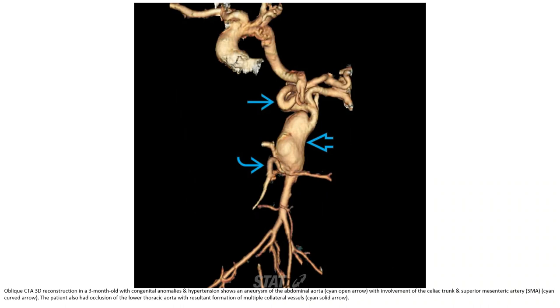CTA 3D reconstruction in a three-month-old with congenital anomaly and hypertension shows narrowing with dilatation of the abdominal aorta with involvement of the celiac trunk and SMA. The patient also had occlusion of the lower thoracic aorta with resultant formation of multiple collateral vessels.